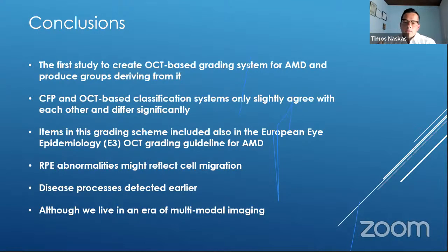Another thing that merits attention and some further research might be interesting on that is what I termed the RPE abnormalities.